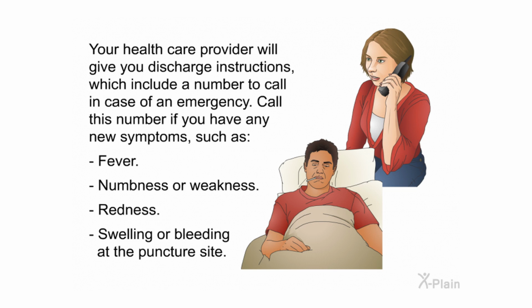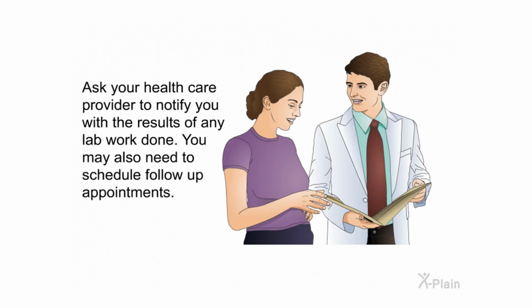Your healthcare provider will give you discharge instructions, which include a number to call in case of an emergency. Call this number if you have any new symptoms, such as fever, numbness or weakness, redness, swelling or bleeding at the puncture site. Ask your healthcare provider to notify you with the results of any lab work done. You may also need to schedule follow-up appointments.